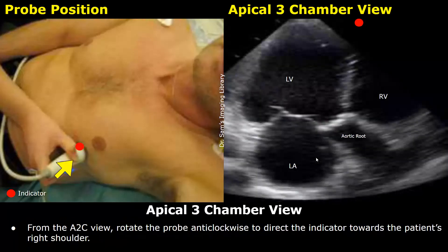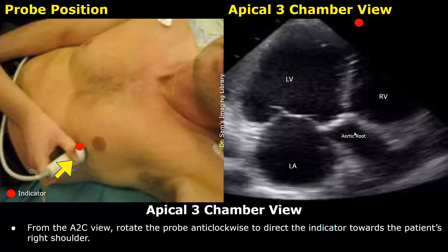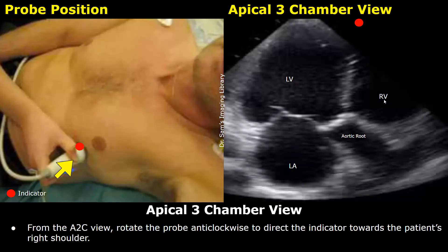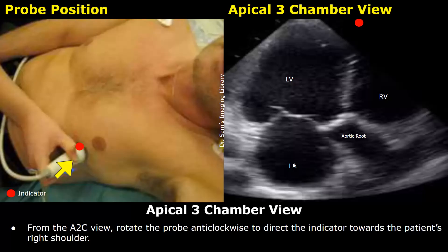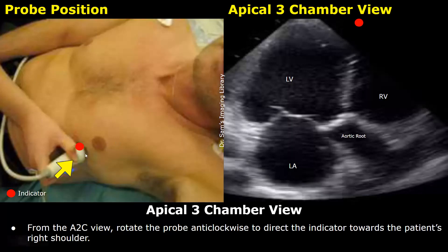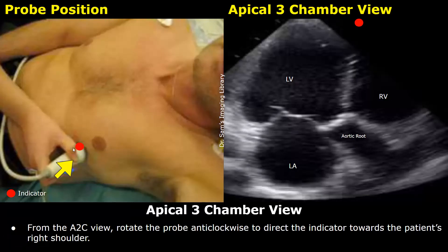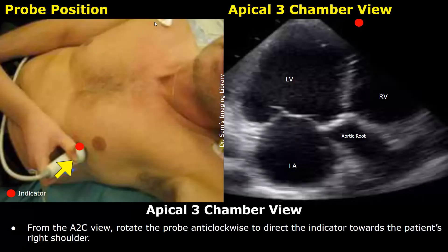After the two-chamber view, we can get the three-chamber view, which shows the right ventricle, the left ventricle, and the left atrium as well as the aortic root. From the two-chamber view, rotate the probe anti-clockwise to direct the indicator towards the patient's right shoulder to get this view.